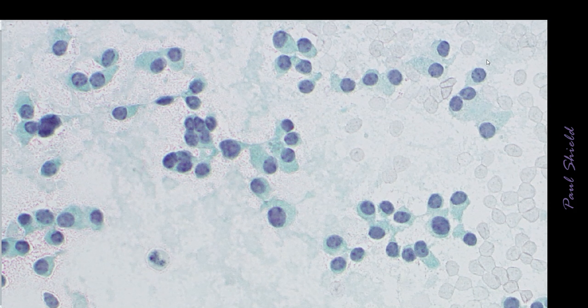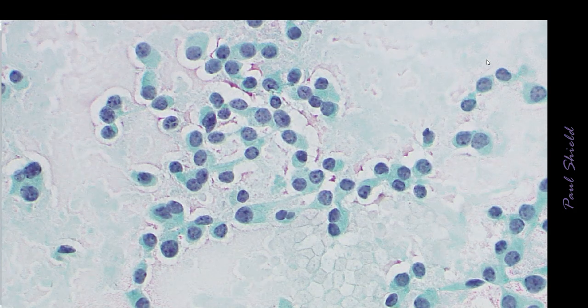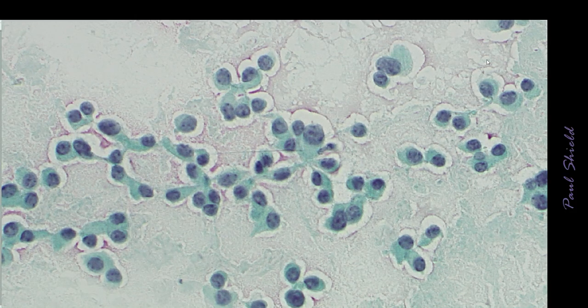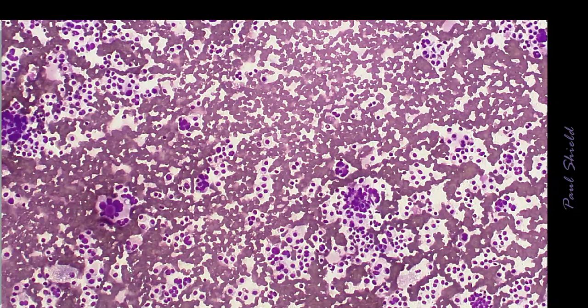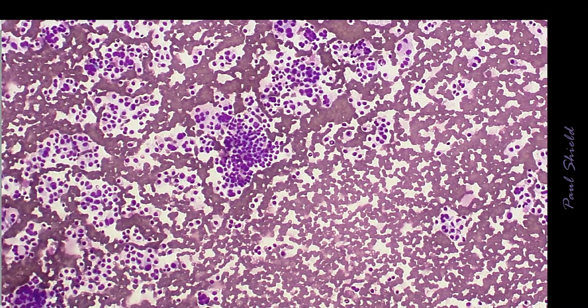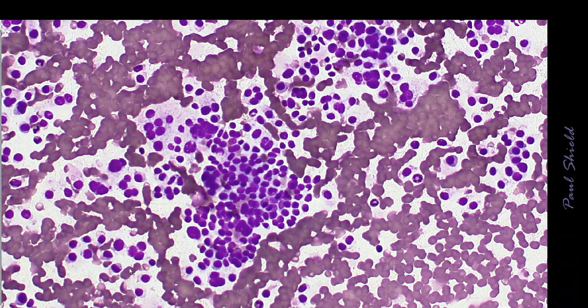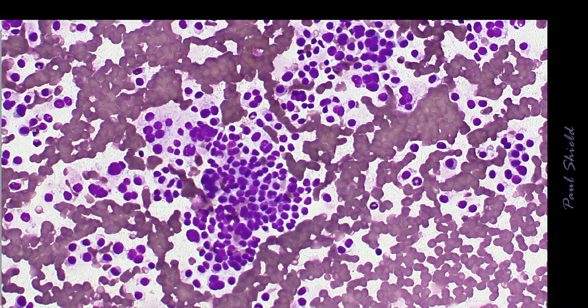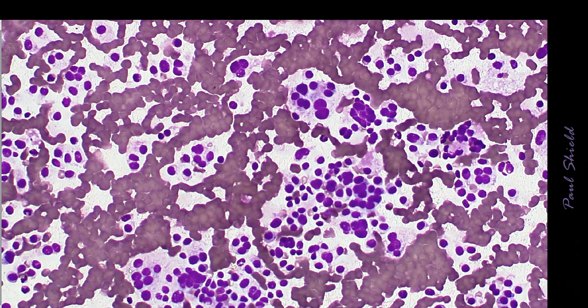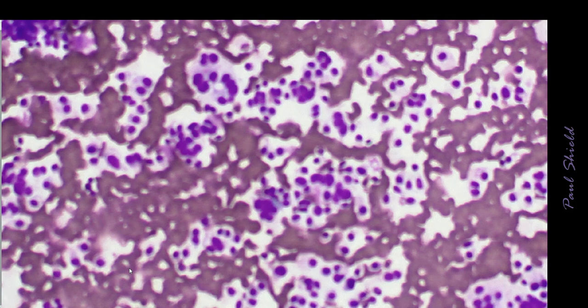This is a PAP, and you can see the same sort of pattern, with cytoplasm on all the cells here. Notice, follicular cells often show little visible cytoplasm when they're single. Nuclei seem to be eccentric in a kind of oval-shaped cell. And down here again, we've got what appears to be more nuclear variation in size than you would normally see in follicular cells.